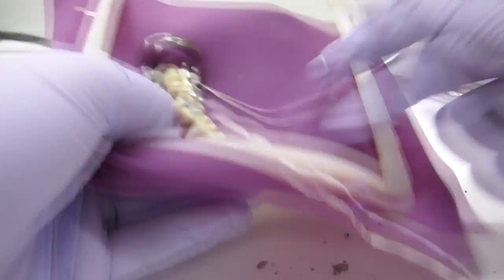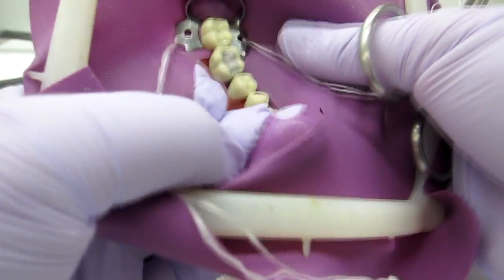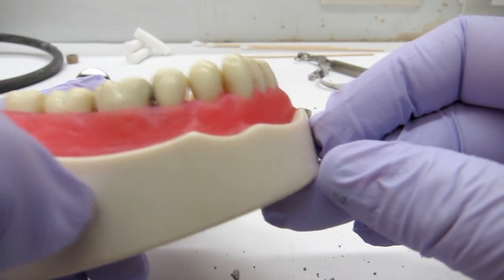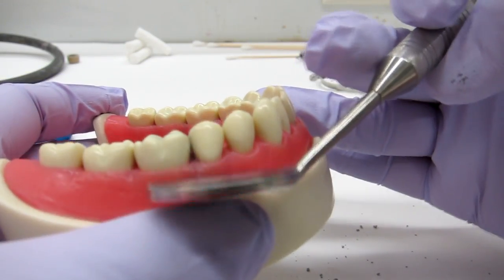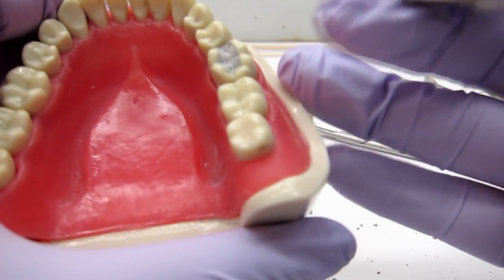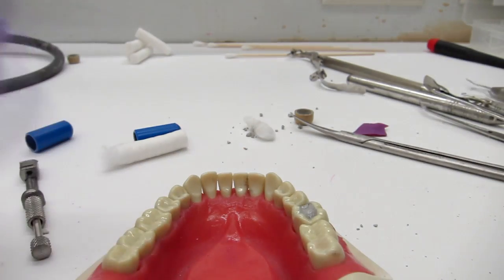Pull out the little wedge and cut all the interproximal rubber dam, especially where your MO is, because otherwise you'll pop off your marginal ridge. Take everything off in one piece, then look interproximally — use a mirror on both sides to make sure there's nothing jutting out. You can use the interproximal carver again; remember to push away from the marginal ridge, push down not up, because you can pop it off.